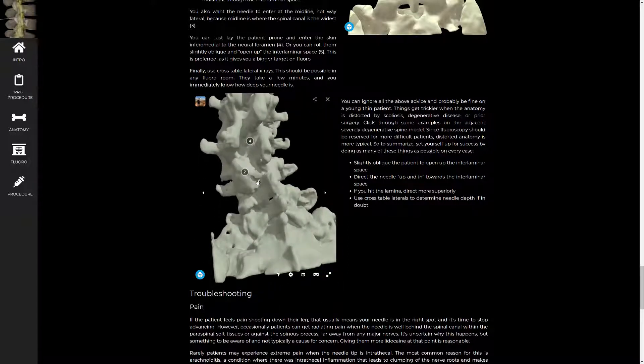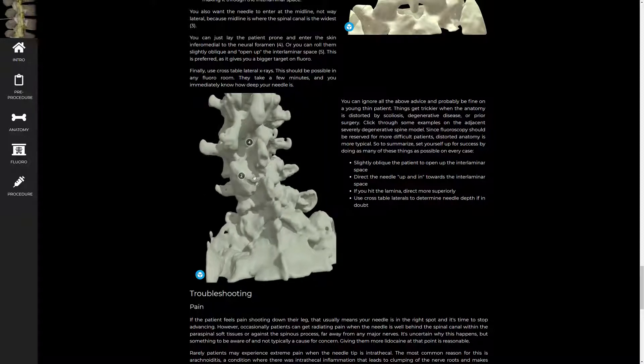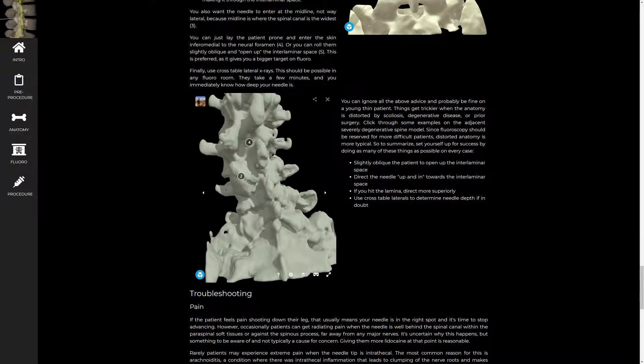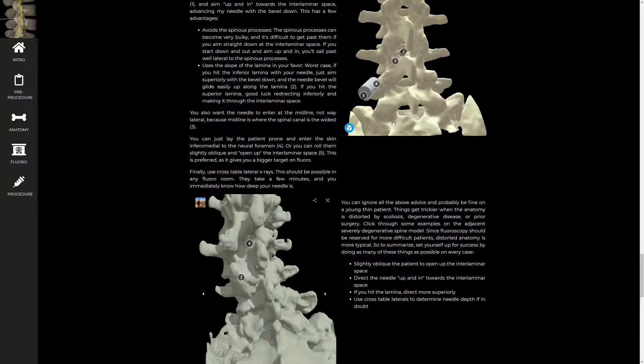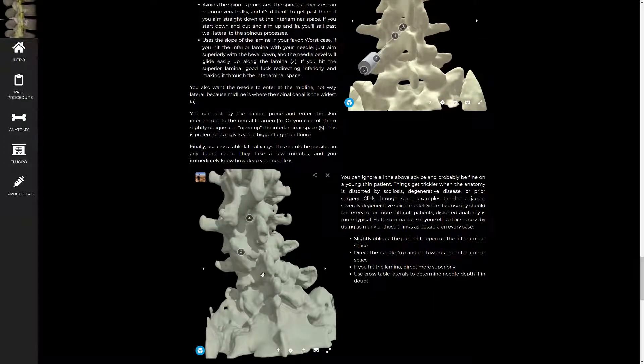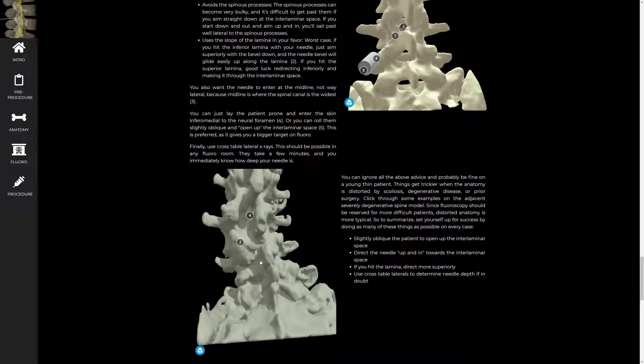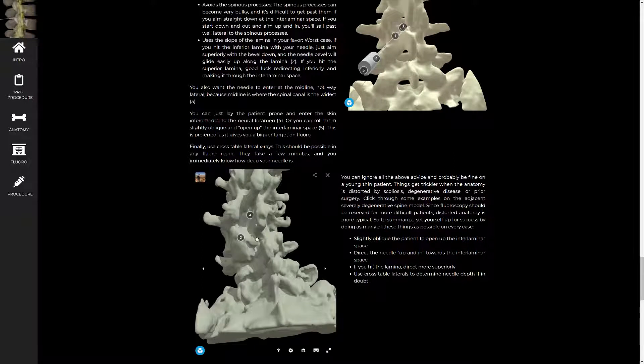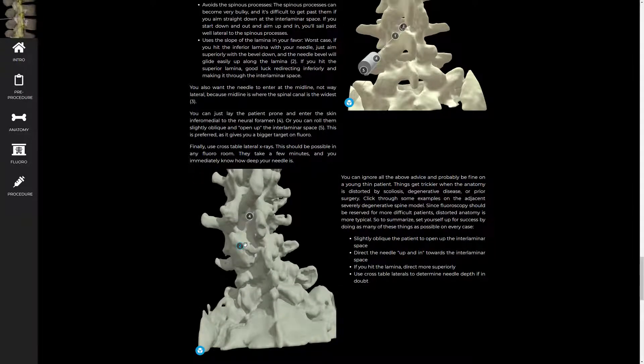The second thing I'd point out is that facet joints can also get extremely bulky osteophytes. This is a nice example here. On a young healthy person, you might look at the facet joints and think, I don't see how those would ever be a problem. They're so far lateral. But you can see how bulky those osteophytes can get, and this would completely block any needle approach to the interlaminar space here.